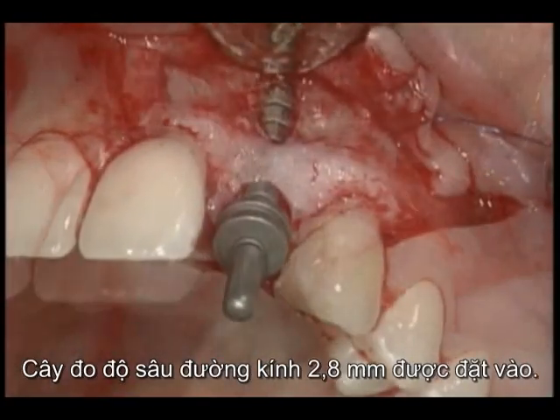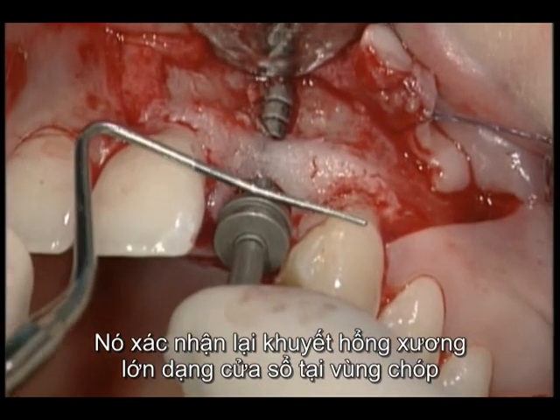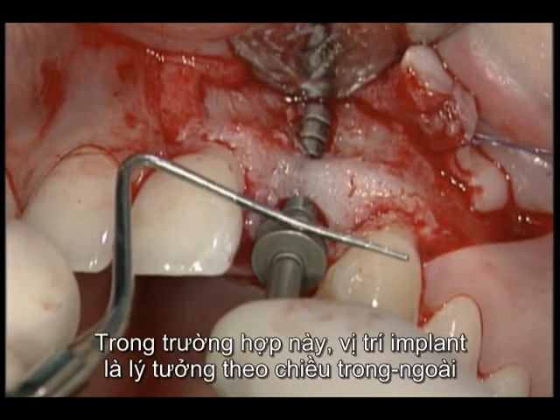A 2.8 millimeter depth gauge is inserted. It confirms the extended apical fenestration defect that will be augmented with the GBR procedure. In this case, the implant position is ideal in the orofacial direction.